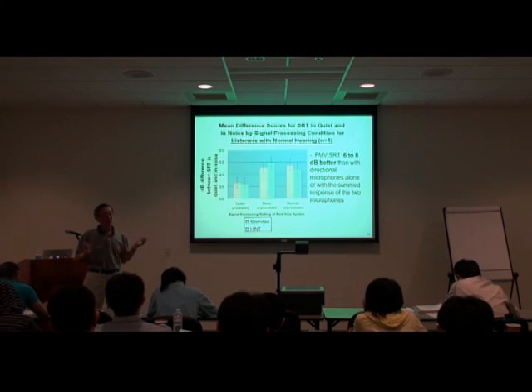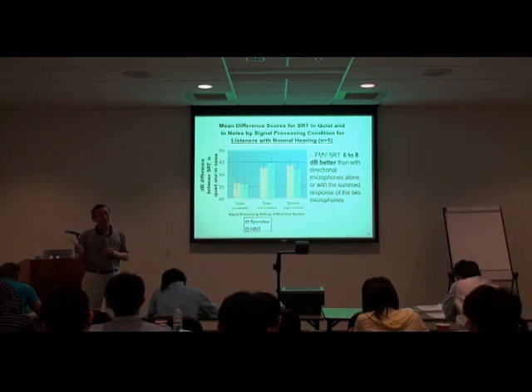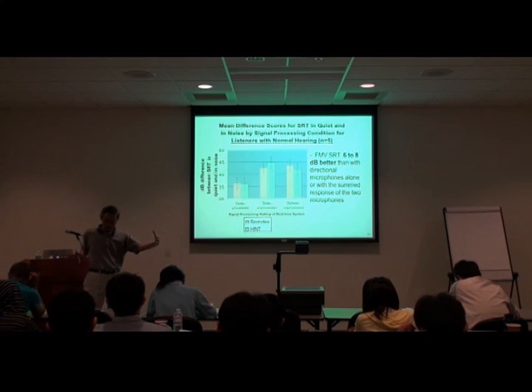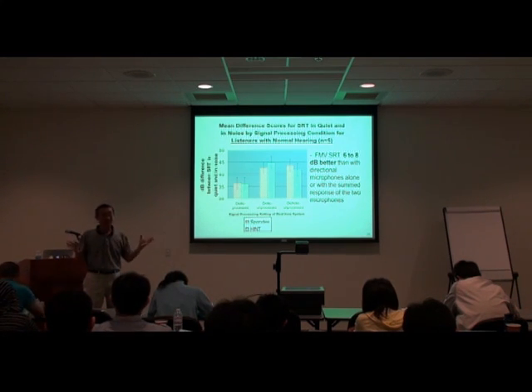They wanted to prove that it works not only in our testing room, where we have anechoic foam to remove the echo, but they forced us to take the system down on a card and computer to the Rotunda. The Rotunda at Beckman Institute is really a circular arena with echoes coming from all over. We had never tested that. Fortunately, our device worked. They were convinced, and at that point they were already ready to license our technology.